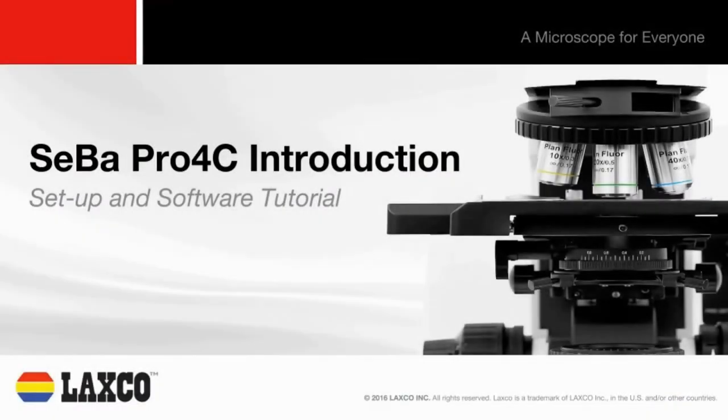Hello, today we'll be looking at your SEBA Pro 4C, how to set it up, and how to use the SEBA View software.